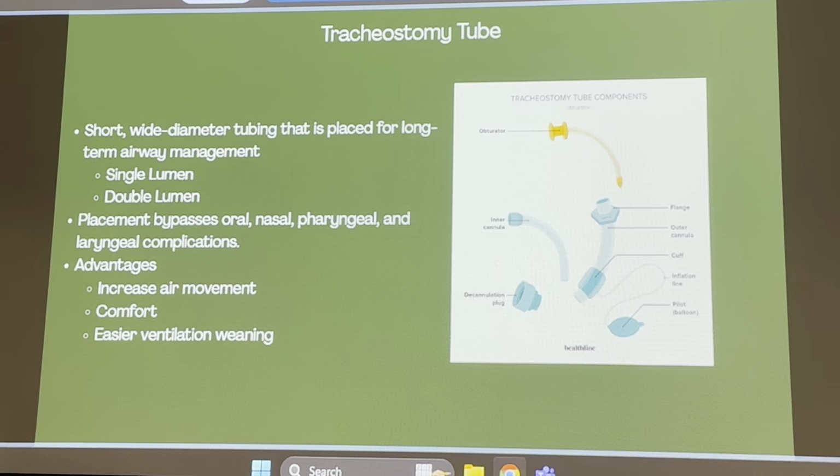With tracheostomies, they have a really good benefit. It clears up basically everything, besides like an endotracheal tube. If you have an endotracheal tube, it's going to sit down in that oral airway and go down into the bronchioles. With that, we're passing over the voice box, the epiglottis, and a lot of different things. So for patients with a trach, this is a long-term, more permanent solution to an artificial airway if they have to have an artificial airway for a very long period of time.